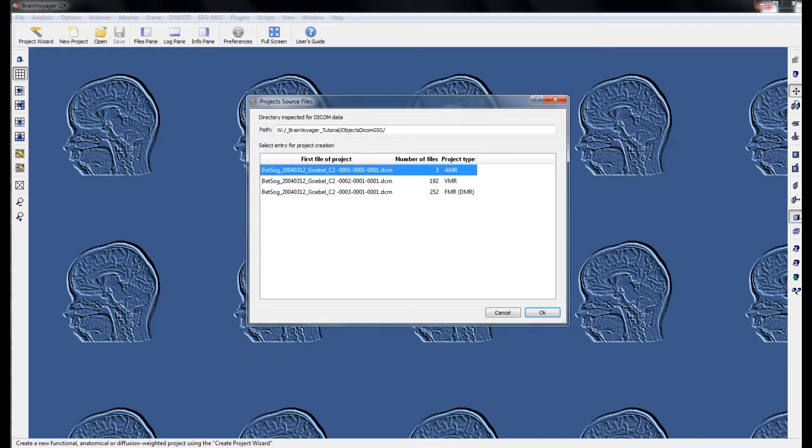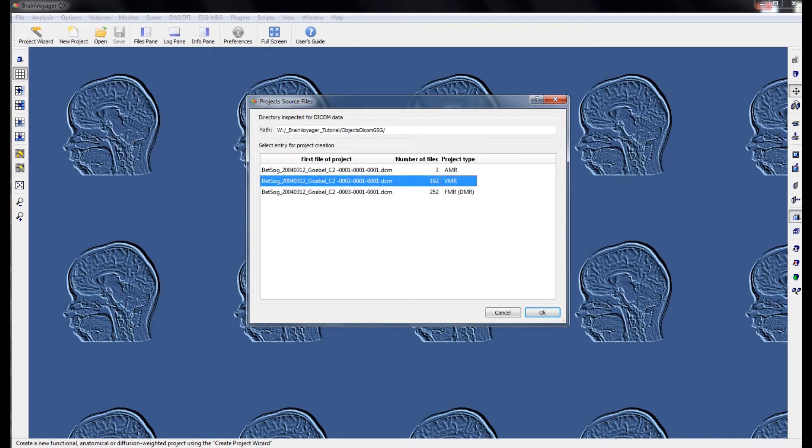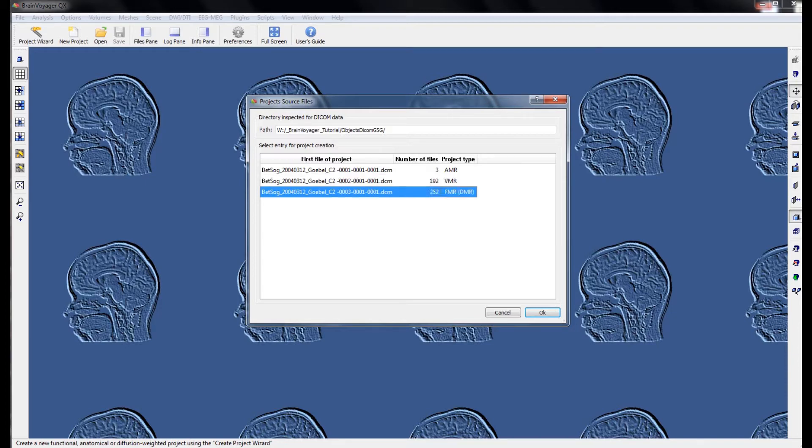Here we can see a 3-volume AMR, a 192-volume VMR, and a 252-volume FMR. We want to select the 192-VMR.